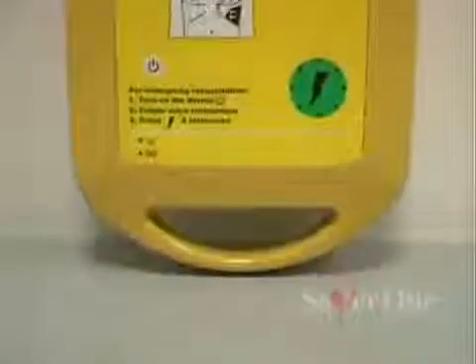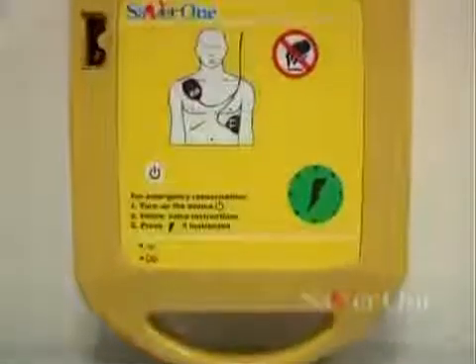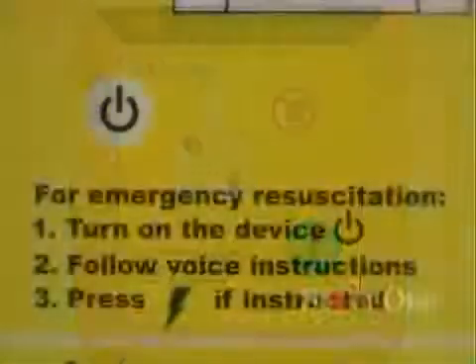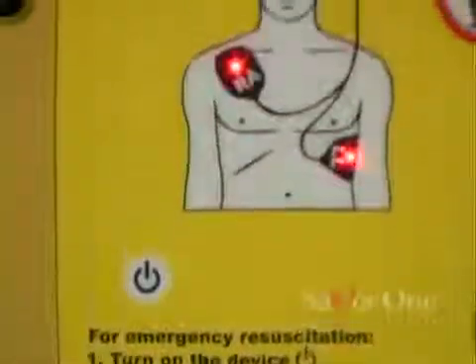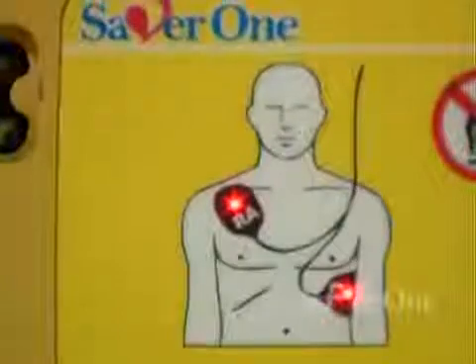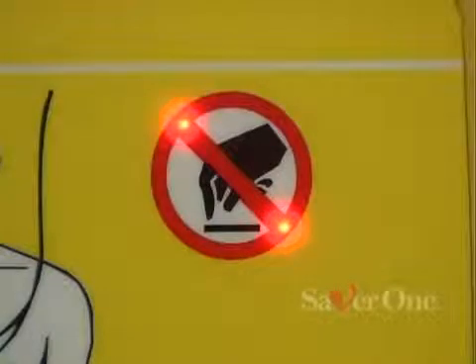The Saver One is an intuitive, easy to use device. It has only two push buttons: a switch on button and a discharge button, which glows when ready to defibrillate. Plus a flashing icon which instructs the operator in connecting the electrodes, and a flashing icon indicating the operator to move away himself and anyone from the patient.